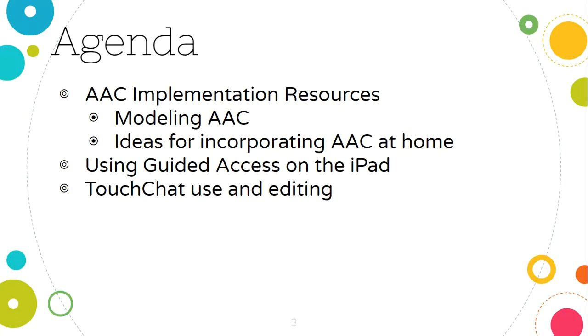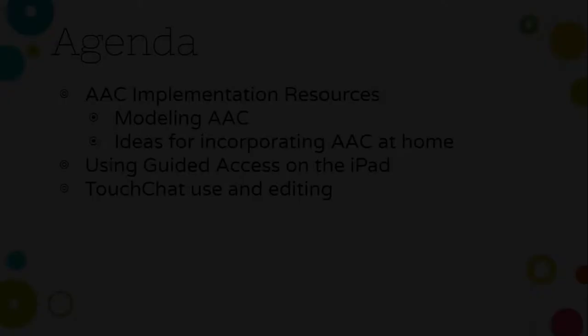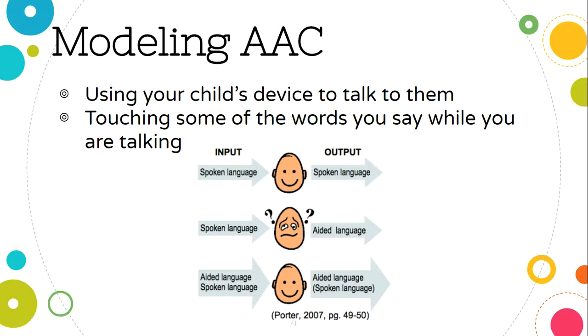So the things that we're going to go over today, we're going to talk about AAC implementation, and we're also going to talk about some ideas for incorporating it at home. We're going to talk about using guided access on the iPad. That's going to lock your child into their AAC app. That's something we do at school. And then we're going to also talk about TouchChat, kind of the app itself, the use of the app, and editing. So we're going to start today with modeling AAC.